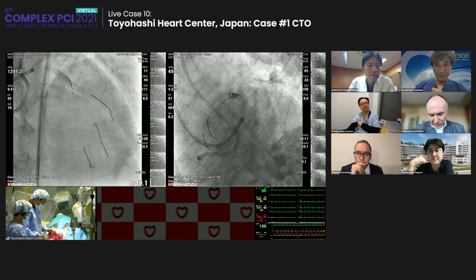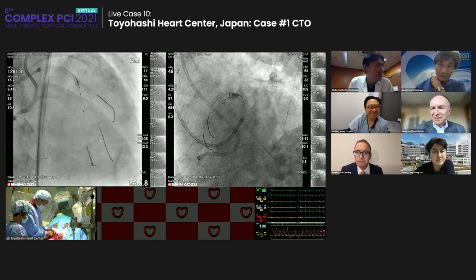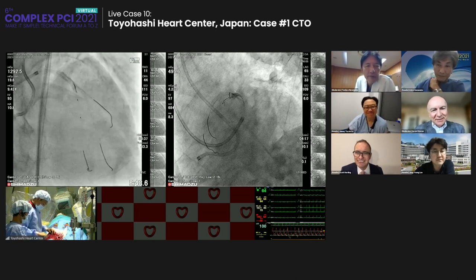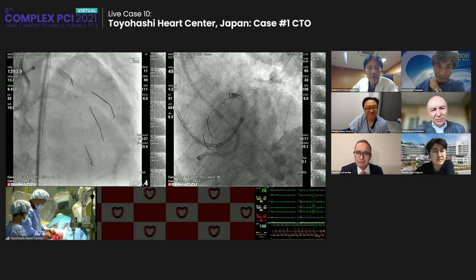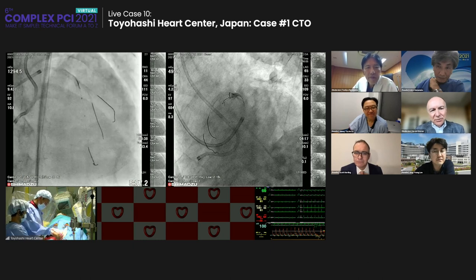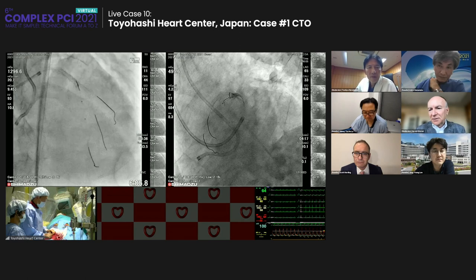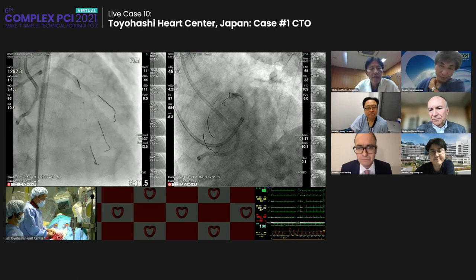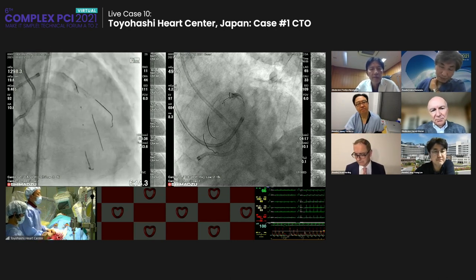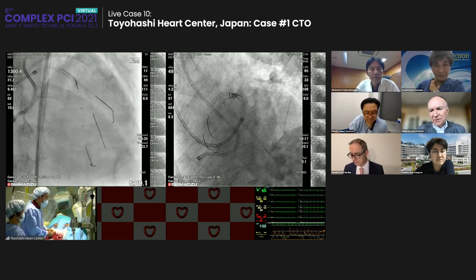Yeah, actually, I'm about to leave for Brussels because there is the European Bifurcation Club meeting today and tomorrow. And I think what I take from the discussions, I'm not a hardcore member there, is that thanks to drug eluting stents, the decision is one stent or two stent. And if you do two stent, I think it's the diameter distribution that basically should determine which way you go. And if it's an even diameter between both branches, then culotte has good results.